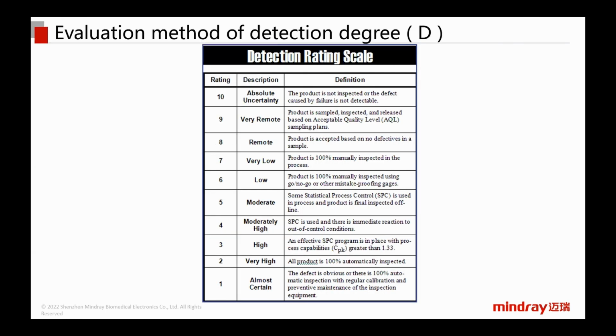And for the last indicator, indicator D, degree of detection, or as I would like to describe it, the difficulty of detection. This represents whether this risk or failure can be detected and stopped before it finally becomes reality. The harder this risk is to detect, the higher its D value is. For example, we found a highly dangerous risk, but the regulation is well established so that we could stop it at the beginning every time. In this case, we consider the risk to have a low difficulty of detection. So this results in a low D rating ultimately.